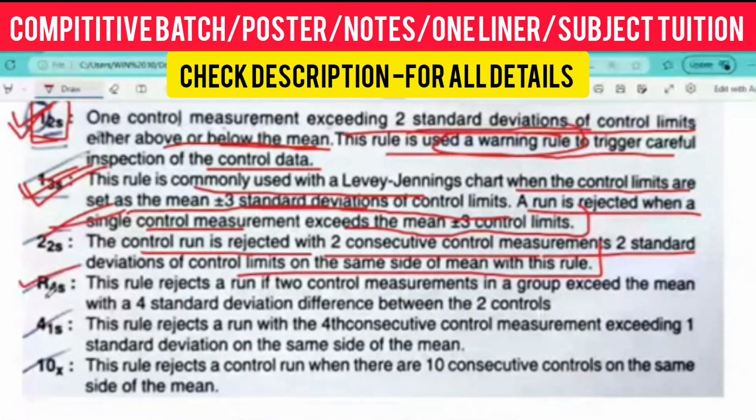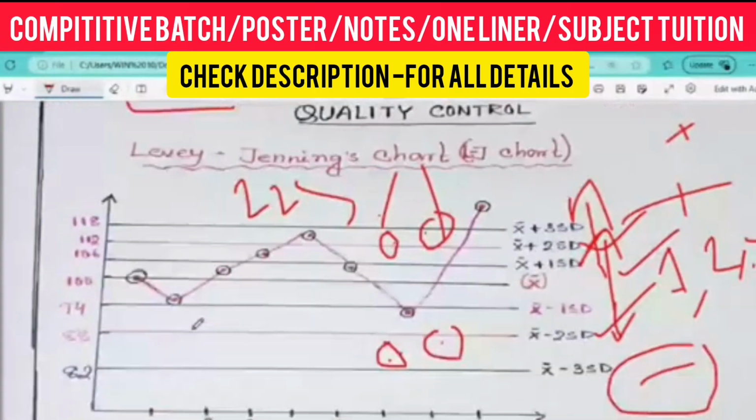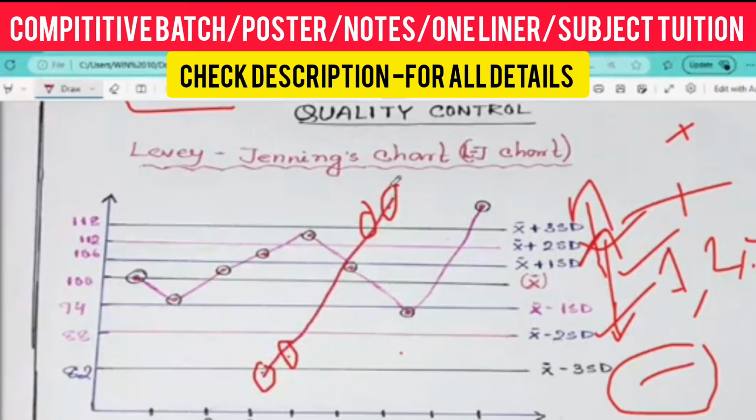The R4s rule: reject the run if two control measurements in a group exceed the mean with a 4 standard deviation difference between the two controls. If two repeated results exceed the positive side of 2s, and another exceeds the negative side of 2s, that is called R4s. Understood? That is called R4s. That is also rejected. Understood? Yes, sir.